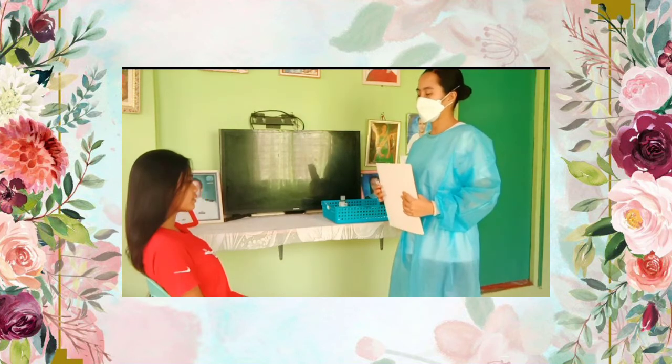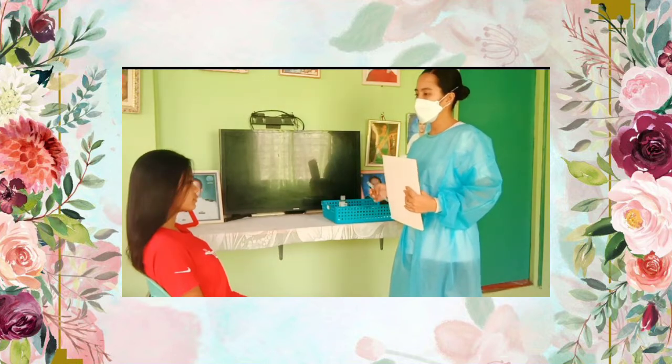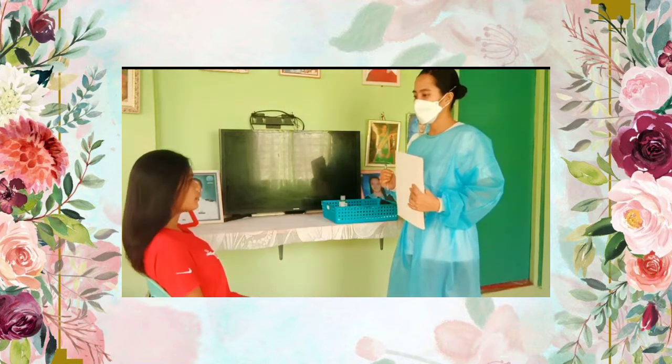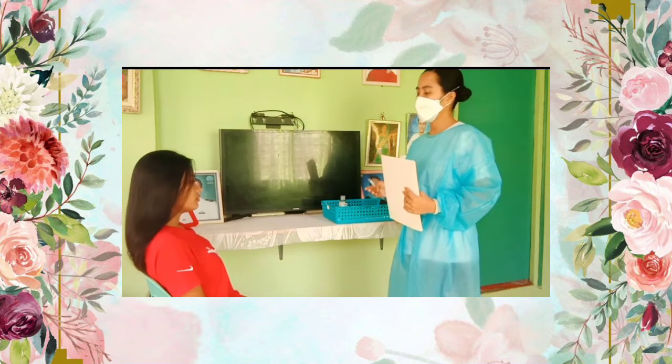Good morning, ma'am. It's nice to see you here. I am Colleen Joy Napatal, your student nurse for today. Now, I am going to assess your vital signs, which includes your temperature, pulse rate, respiratory rate, blood pressure, and pain as our fifth vital sign. Would it be okay with you, ma'am? But before I proceed, may I know your name, ma'am? I am Jezabel Satumbaga. Can you state your birthday, ma'am, please? August 2, 2002. Alright, thank you, ma'am, for answering my questions.